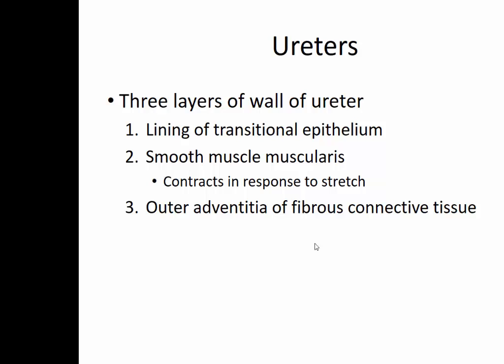So what should we do then for those of you that work in healthcare? What should you do when you're taking the patient to the potty every hour for only a little bit of urine? Well, before that, a bladder scan. Yeah, it's an ultrasound thing, real easy. They have them on the floor. You squirt a little gel, just like if you've ever had a baby, and you put the wand over where the bladder would be, and it'll tell you how much urine is still in the bladder. And if it's greater than about 300, then we think, okay, we've got to do something here, because that's too much to be sitting in the bladder after having just gone.